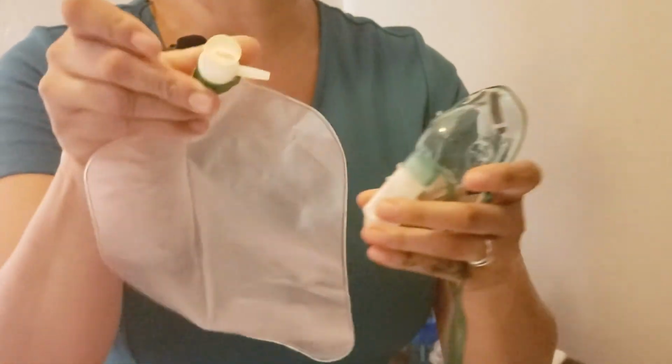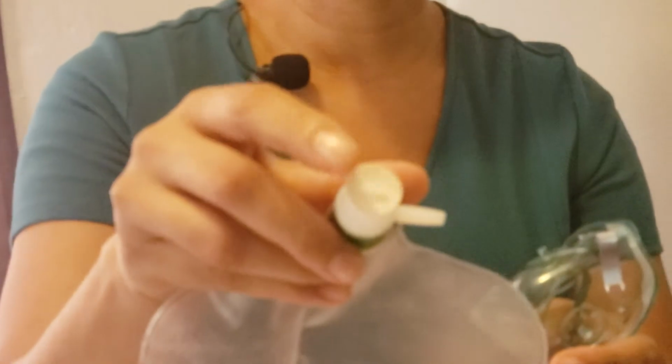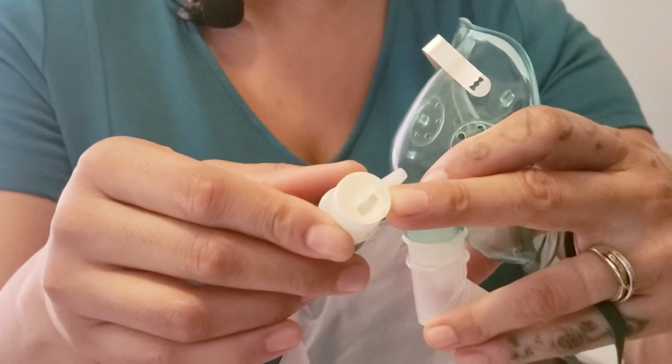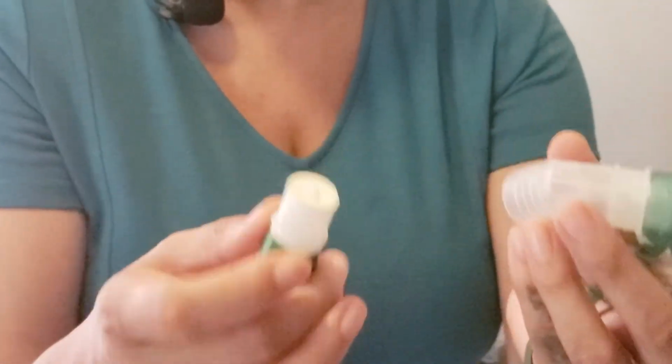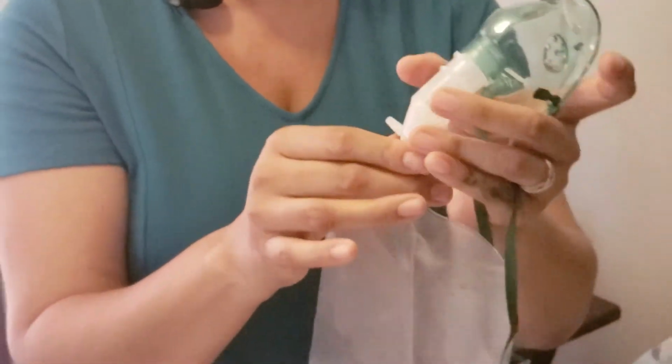This is a non-rebreather mask. They are not rebreathing their carbon dioxide. So when they breathe out, that little flap raises a little bit and it lets that out. There is also another tab inside this one. See, this one has its little white tab. What that white tab does is to stop the air that the patient has breathed out from going back into the bag, because what they're doing is to breathe fresh oxygen each time they take a breath in.